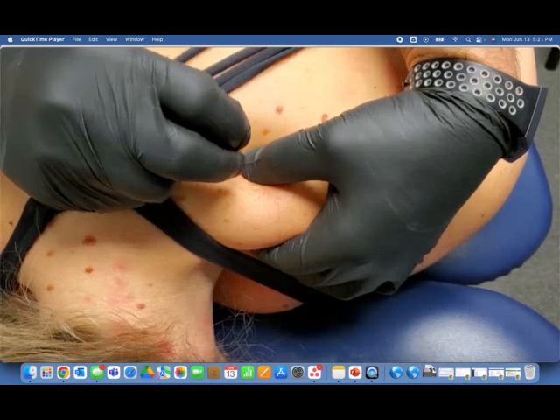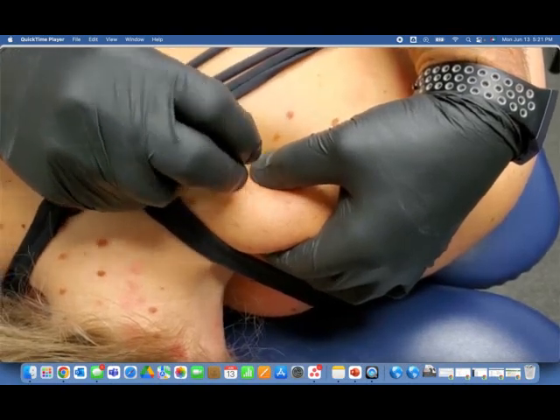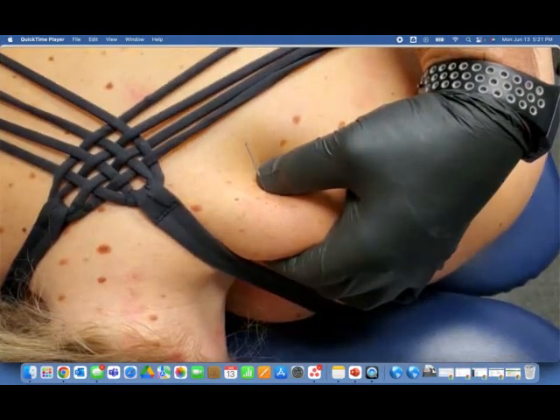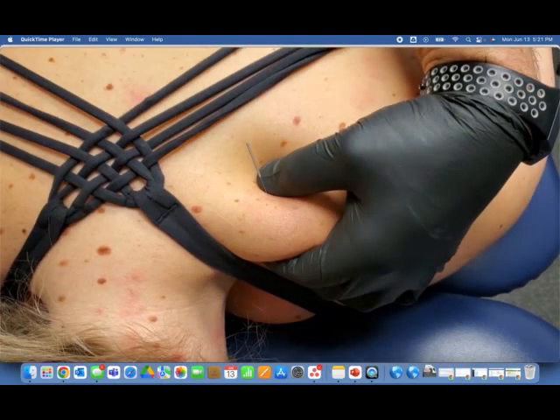So as far as one of the more common needlings that you will do, upper traps are just a great release. You'll probably note if you look at the research, the majority of the research that's out there is heavy about the upper trap. The upper trap is very prominent with the twitch or the spontaneous electrical activity. I don't advocate pistoning, as you may already know.